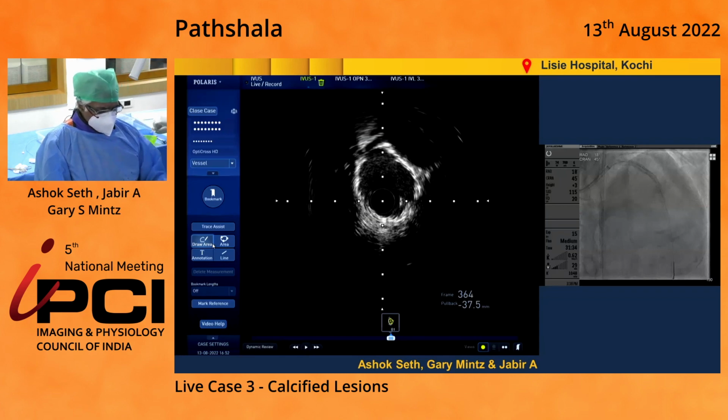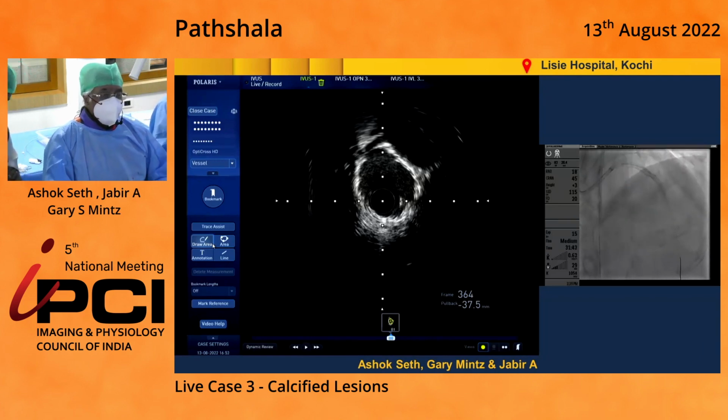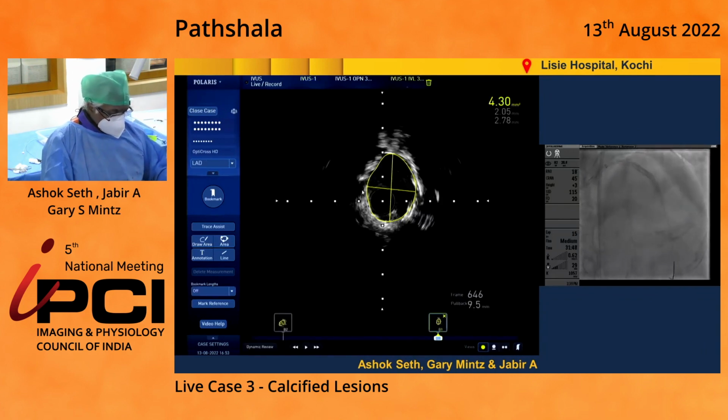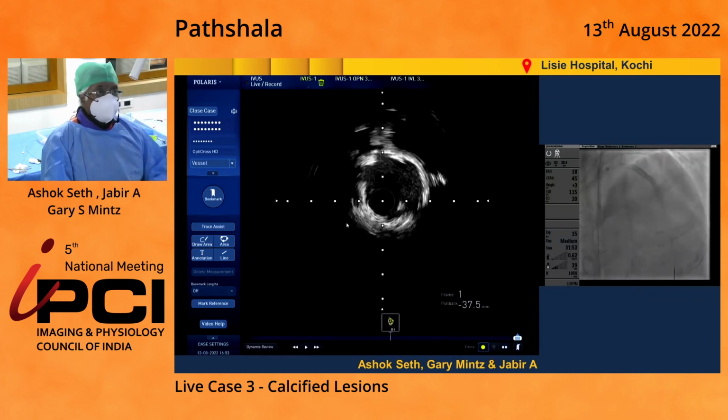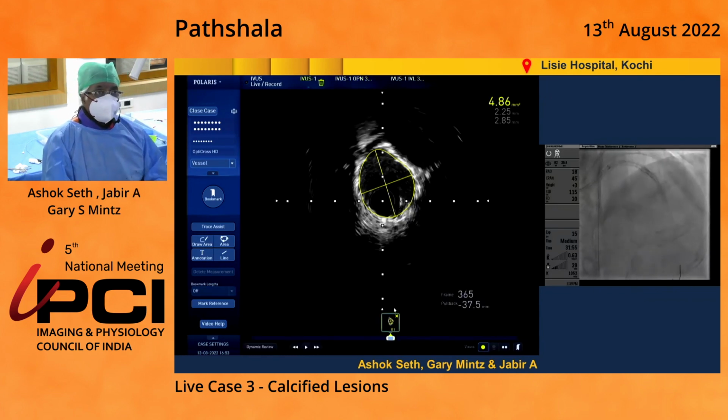And certainly one of the things, of course, I'm going to do is use the OPN on the proximal lesion as well. We must remember that we've got to optimize that as well. And then finally, we would end up with a drug-eluting balloon, I think, because the stent has been messed around quite a lot, and we don't know what its drug elution characteristics are, as it has been intervened at least 3 times in the last 1 month. So we've got to take care of it. I think that makes a lot of sense.